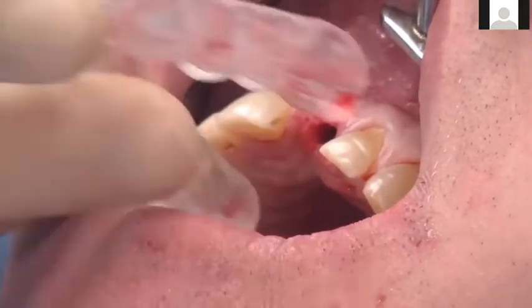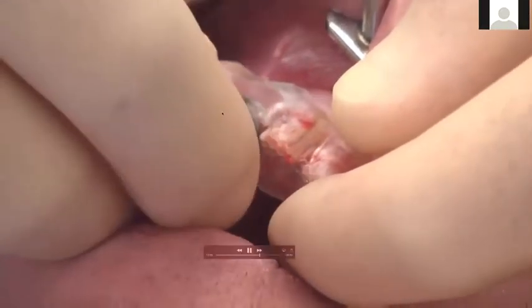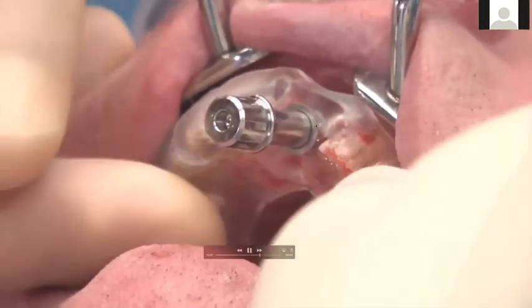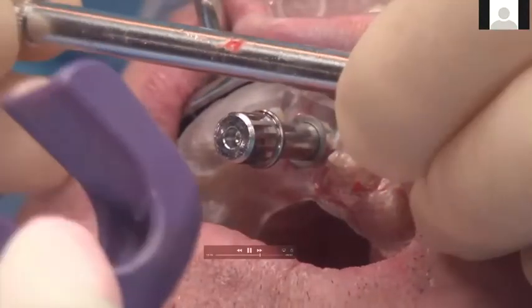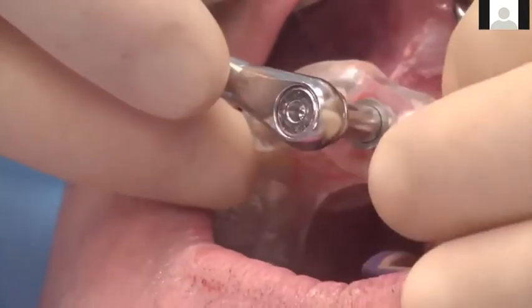So we go ahead and put our guide back on, and the new mounts, the new drivers that are available, they fit like this. This is an old one, but they fit exactly like this into the master sleeve, so that you don't have to use those guided mounts like I just showed you anymore. And those have the markings on them as well.